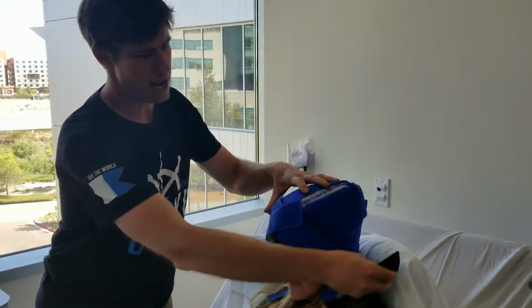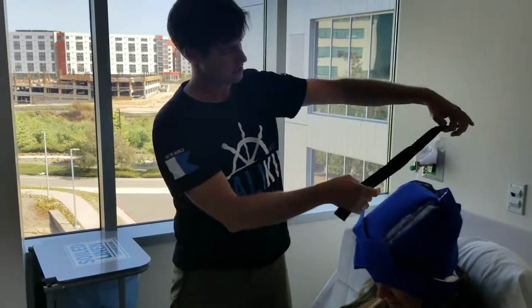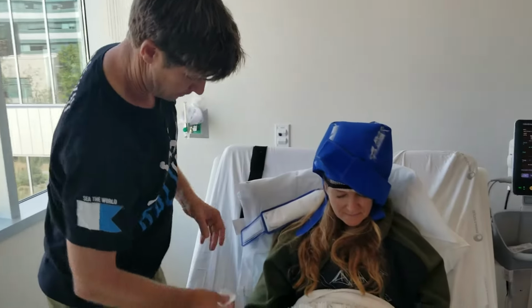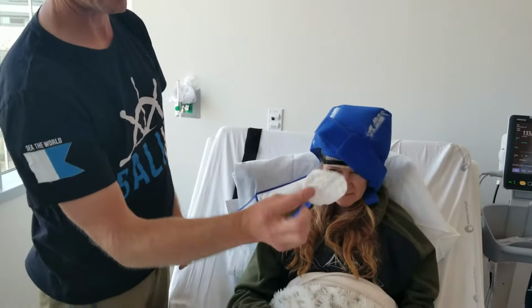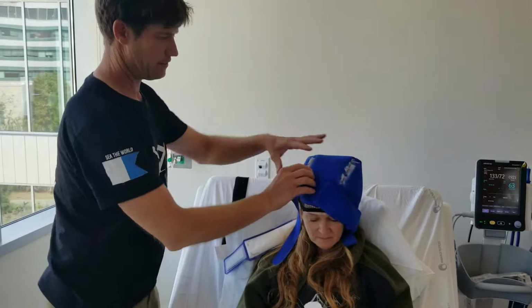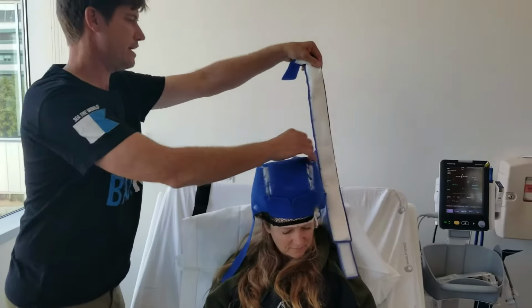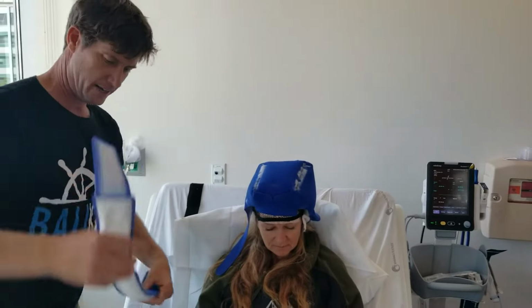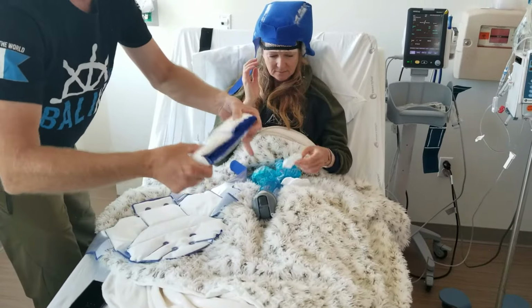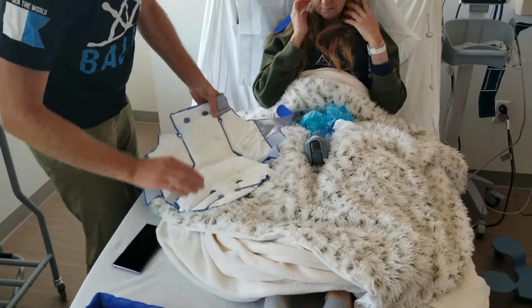It comes with 3 straps. We've really only used one. So we take the one strap off and put it aside like that, and then I'm taking the band off. We've used these little pads, and I'll get to that a little later, to keep your ears from getting frostbite, because you want to cover up your skin. If your skin is not covered, you will get frostbite from this, and you definitely don't want that. I put this aside. Typically I just fold the ears in and fold it up like that, so I've got a nice clean thing. I put that aside, and now I've got my cap that's going to go on.